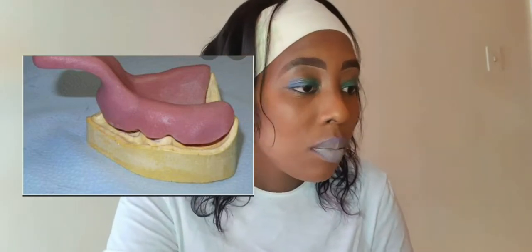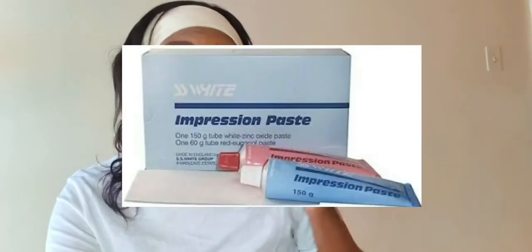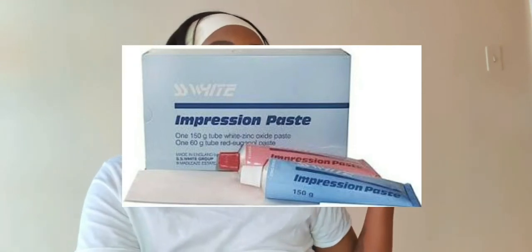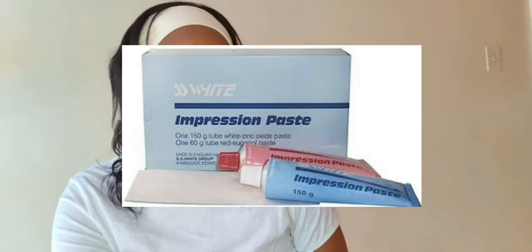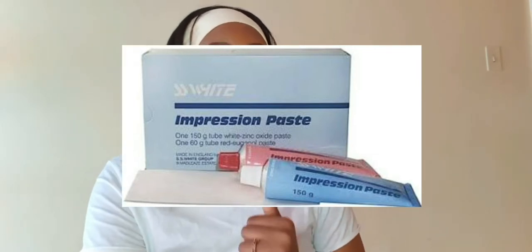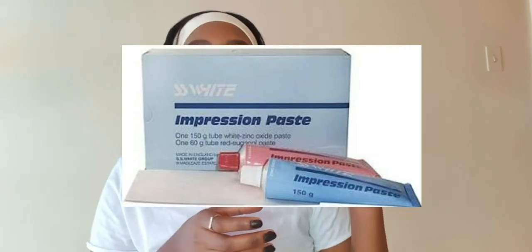So this final impression will still be in our special trays. In this appointment, the impression is taken in the special tray that we got back from the lab, using zinc oxide eugenol impression material. So yeah, we use ZOE. We're going to mix ZOE, place the material in the special tray, and then we take our impressions again.